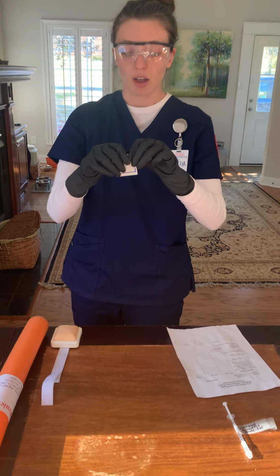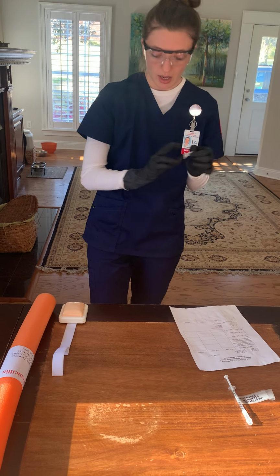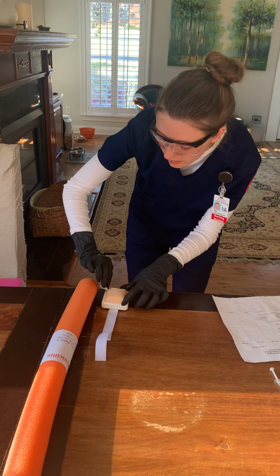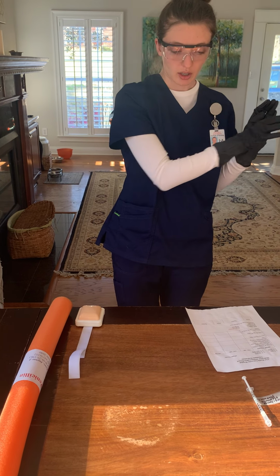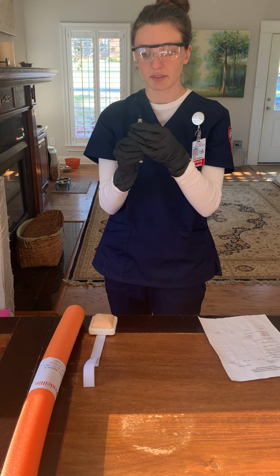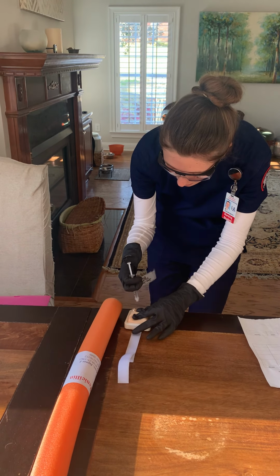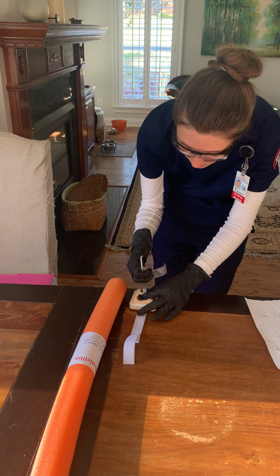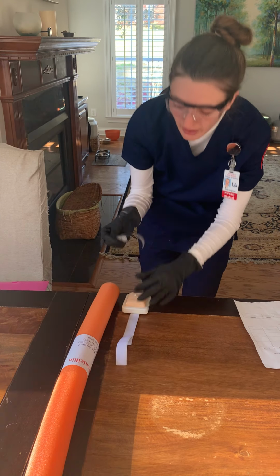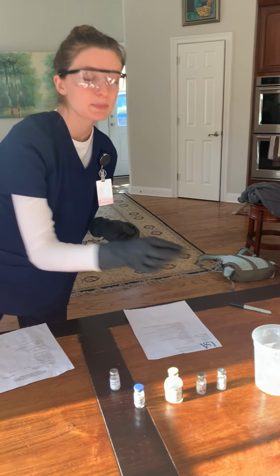So I'm going to take my alcohol pad and clean from the inside out, making sure I never touch it again. Perfect, discard. I will now take my heparin. I will drop the safety on it. I will pinch the skin, and then I will inject at a 90-degree angle. And I'm injecting the heparin. Okay, I will now put the safety back up so I can discard it into the sharps container.